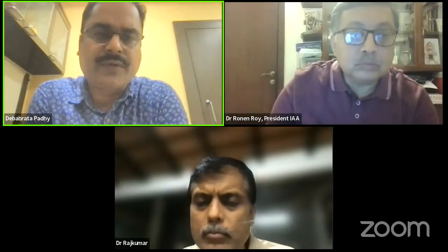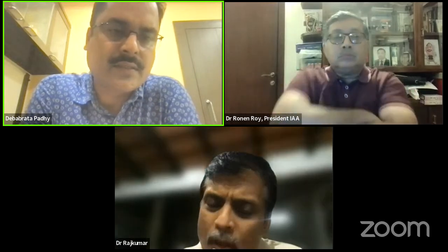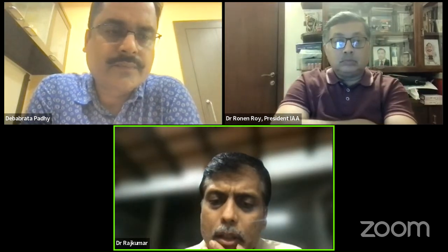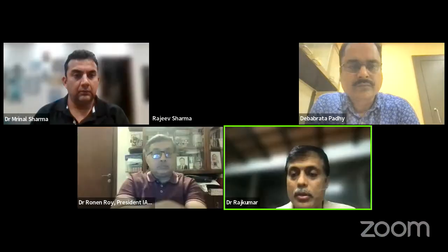How long should be the femoral stem in these prostheses, in these mega prostheses? So actually, we don't have much of options available in these kind of prostheses because they have only limited lengths, because the minimal bone removal is around 80 mm. So you cannot have too long a stem, and you cannot have a shorter one. So this is the smallest length available in a cemented tumor prosthesis, which I have used.